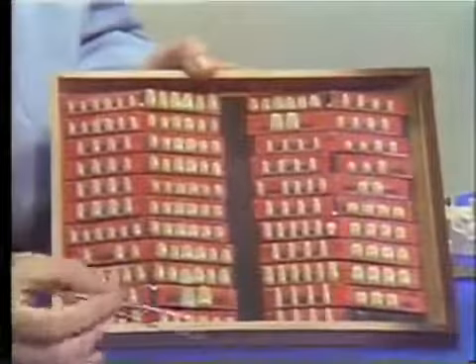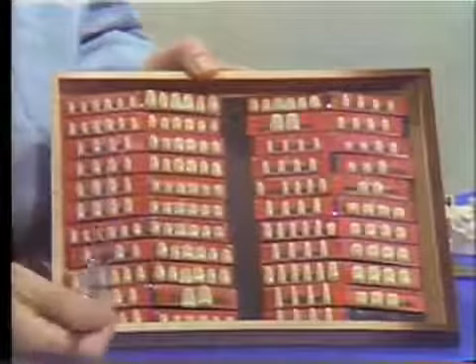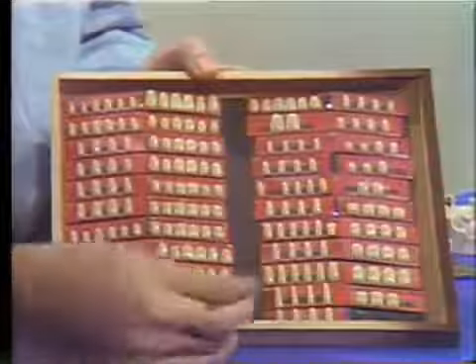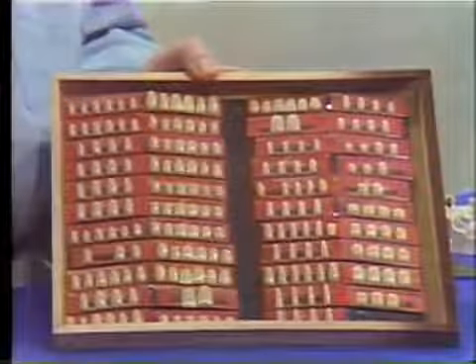Whichever type of facing you're going to use, the mold is selected from the same mold guide. And here we have the mold guide for these Steele's flatback teeth. They come in quite a reasonable range of maxillary anteriors here, molars here, mandibular anteriors, cuspids, and so on. So with this, it's possible to select reasonably well a tooth that will match any particular case.